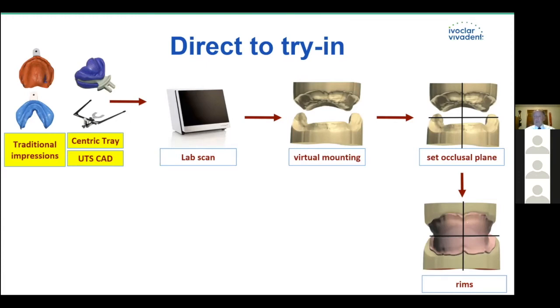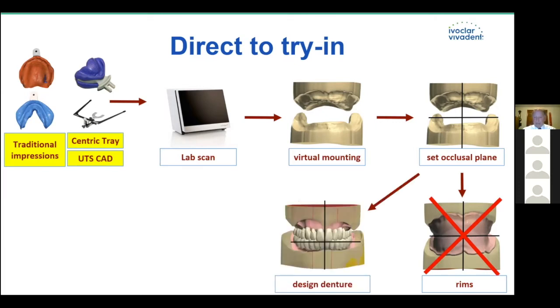We started with, again, being encumbered with the traditional dentistry, we thought we had to make rims. So we start this process, get to this point, and then we'd have to go into a different design process to make and design rims. And thinking about this, why? Because it's just as much trouble. In fact, it's even more trouble, to be quite honest with you, to make a rim than it is to actually set teeth. And so why not skip this spot?